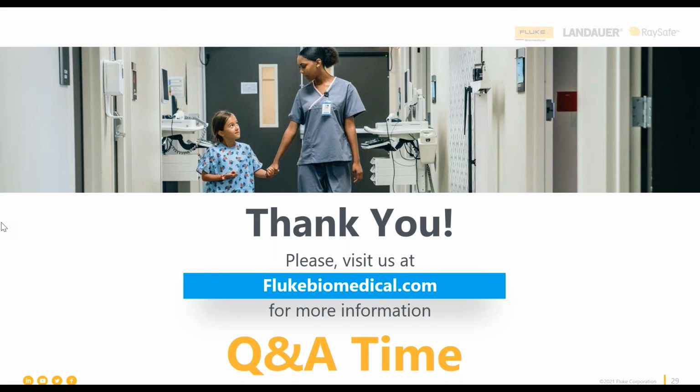These cables, Justin talked about them being a certain length. They're antennas. So shortening or lengthening that antenna through coiling or crossing can have a huge effect on your readings. So don't let that happen. Make sure your cables stay as separated as possible. And again, make sure that your cables are in good working order and that you don't have any loose connections.